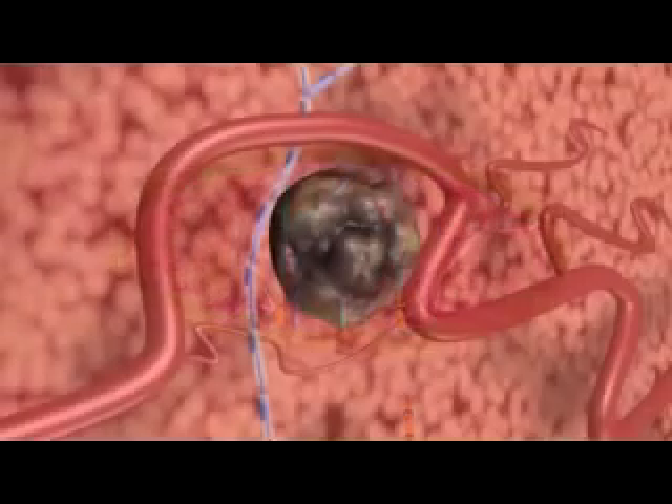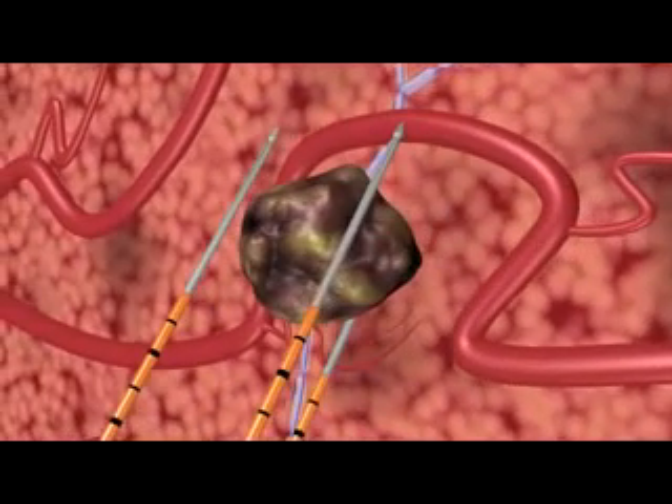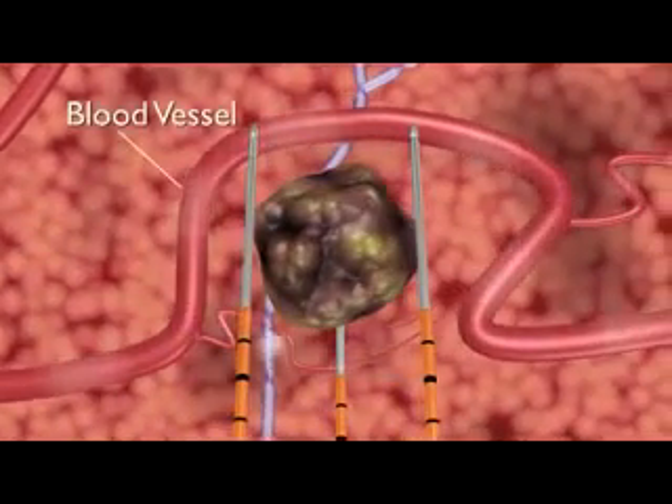NanoKnife electrodes are placed in proximity to the targeted lesion. But, unlike thermal ablation technologies, surrounding critical structures, including ducts and blood vessels, remain functional during treatment.